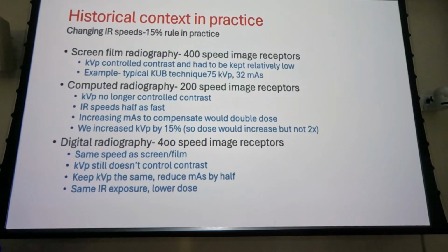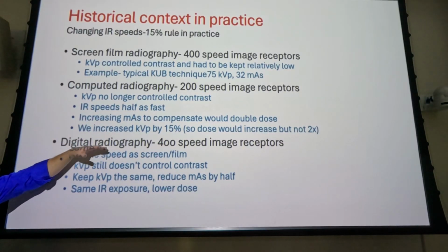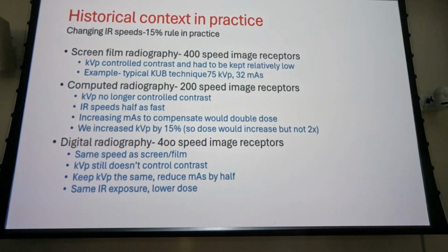We had to use adequate kVp to get penetration through the patient, but we didn't want it any higher than that because we would sacrifice contrast. Differential absorption would go down, penetrate more stuff, we'd have more scatter towards the image receptor, it'd screw up our contrast. Didn't want to change our kVp. But now that we've gone to computed radiography, which has a lot of the same characteristics as digital as far as computer processing goes, what controls our contrast? The algorithm, computer algorithm, the lookup table. Okay, so file that away.